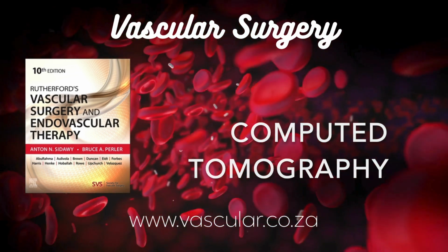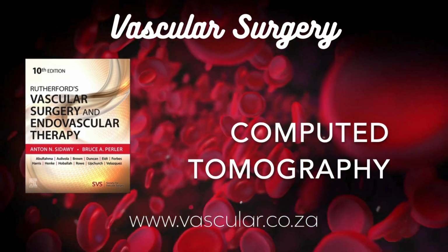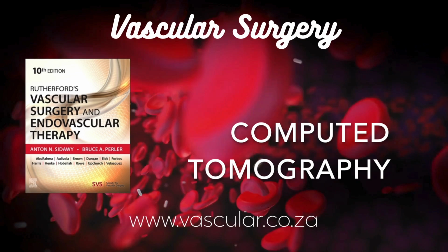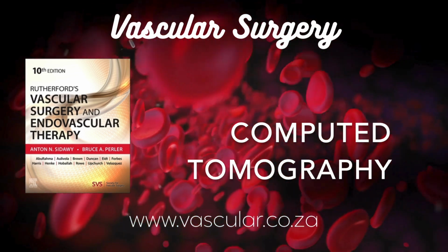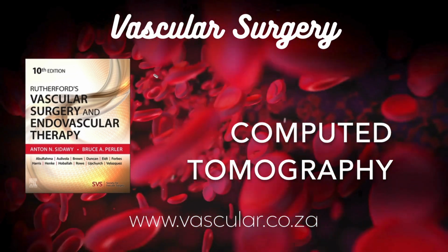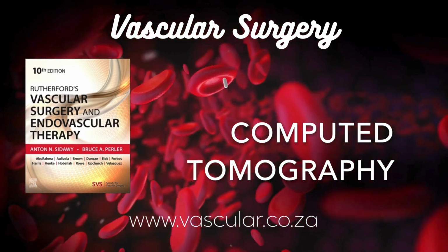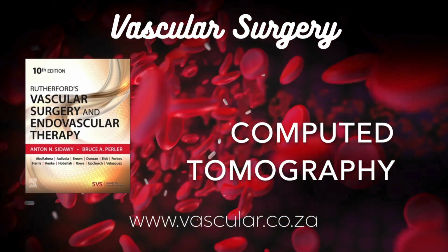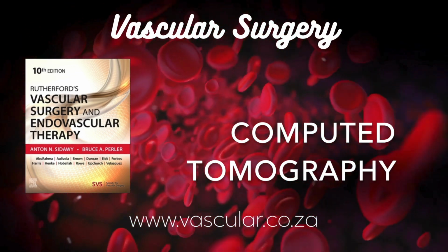But you can also create oblique planes angled any way you need to follow the path of a specific blood vessel, for example. Really helps understand the 3D anatomy. Must be crucial for planning surgery. What about measurements? Are they straightforward? Well, they're better than they used to be, but still need care. On simple axial slices, if a vessel isn't perfectly perpendicular to the slice, you get an oval cross-section, not a circle. Measuring the diameter accurately on an oval is tricky.